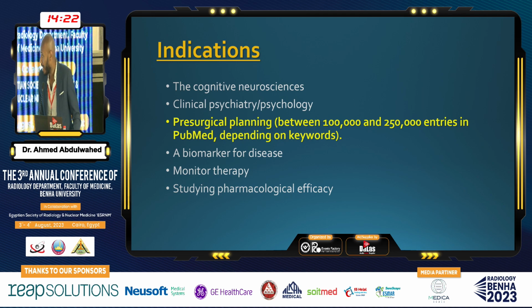So what are the indications? Of course, the most important thing is pre-surgical planning for intractable temporal lobe epilepsy or brain tumors. It's gaining popularity in cognitive neuroscience and clinical psychiatry nowadays.